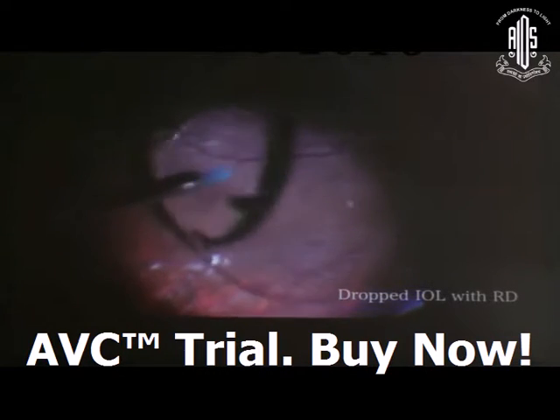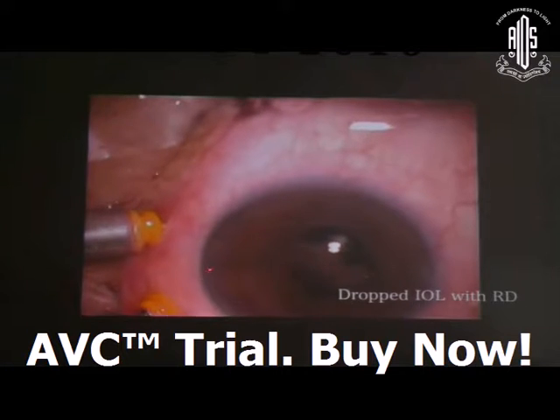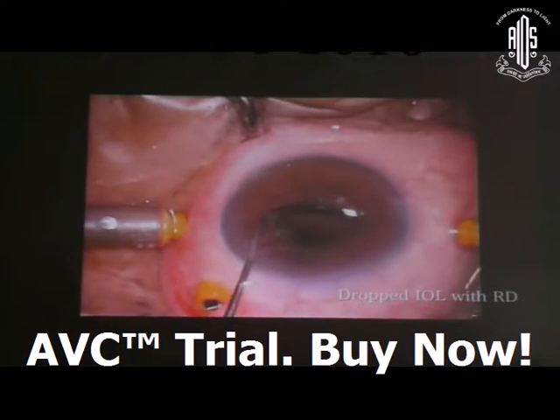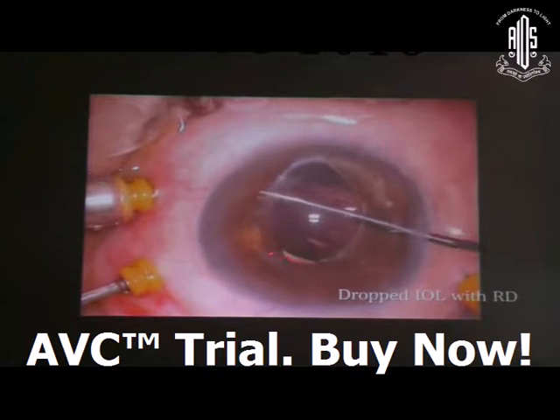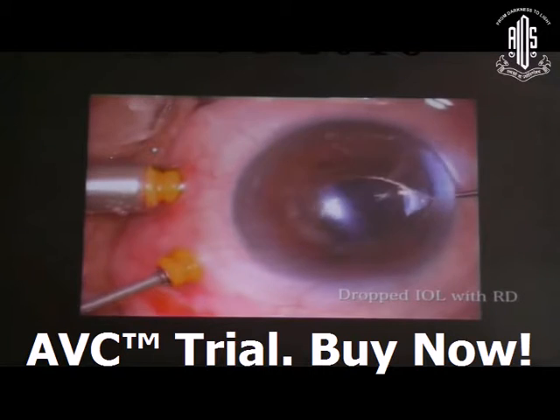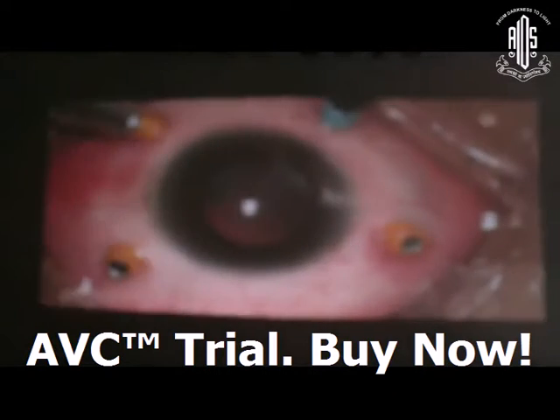You can use the safe technique of a silicone tip backflush needle to bring the IOL just behind the pupillary plane and prolapse the IOL into the anterior chamber. In this situation, fortunately the anterior capsular rim was present, so I placed the IOL in the sulcus and treated the case as a pseudophakic retinal detachment. Then you can proceed with surgery as a pseudophakic retinal detachment.